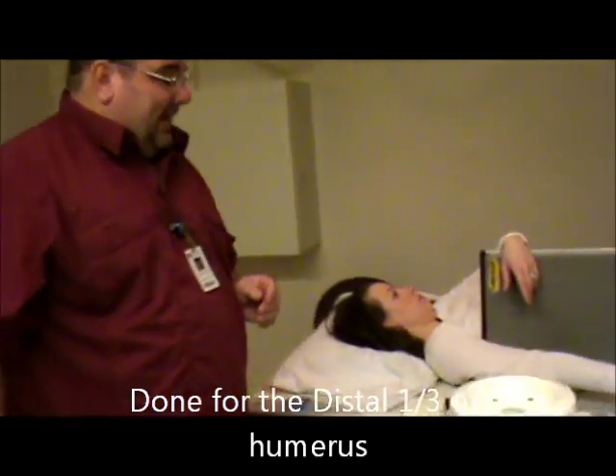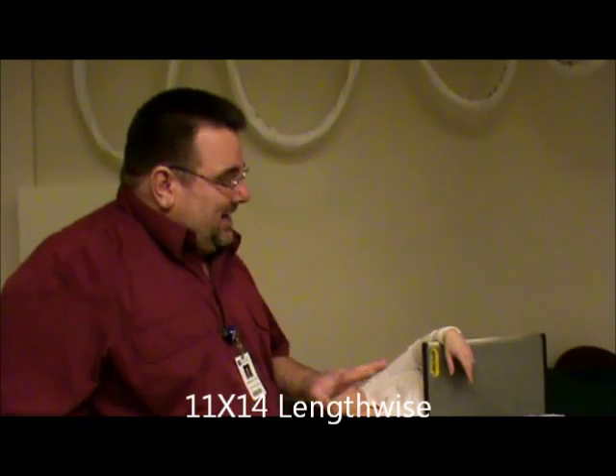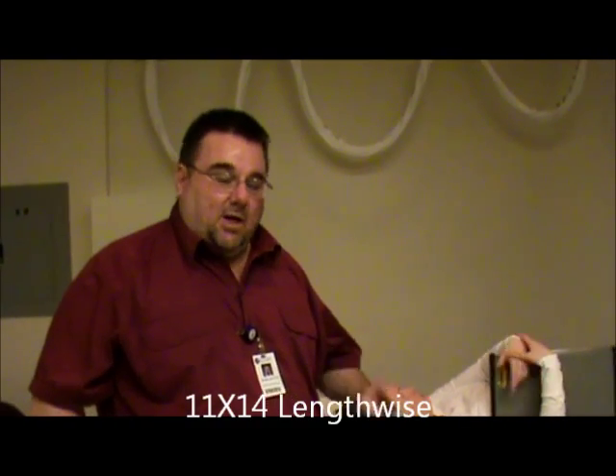The patient's going to be lying supine on the table. We're using 11 by 14 film size lengthwise. Our technique is going to come down just a little bit — we're probably going to use something like 8 mAs at 57 kV, because we're only seeing the distal part: the distal humerus and part of the elbow.